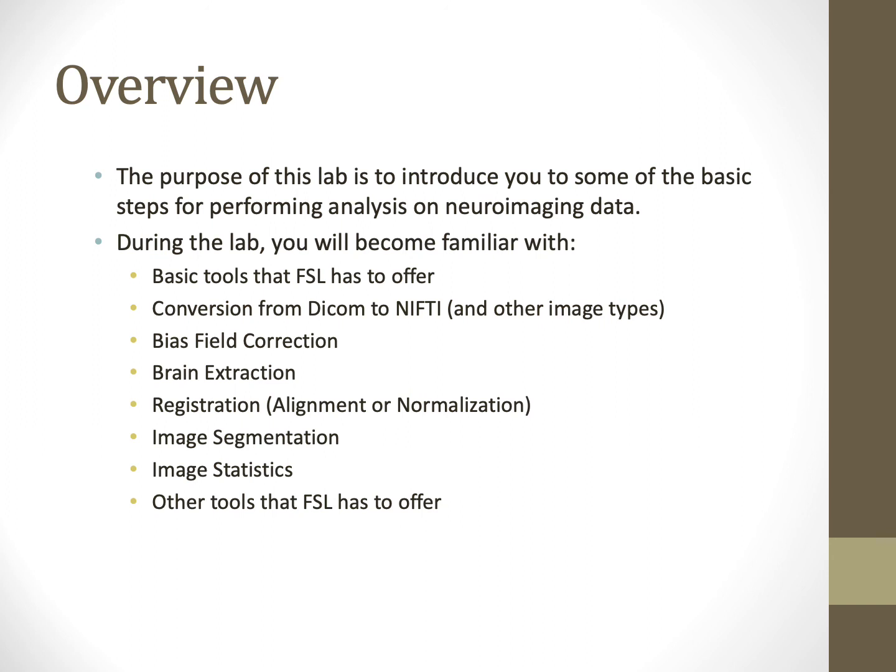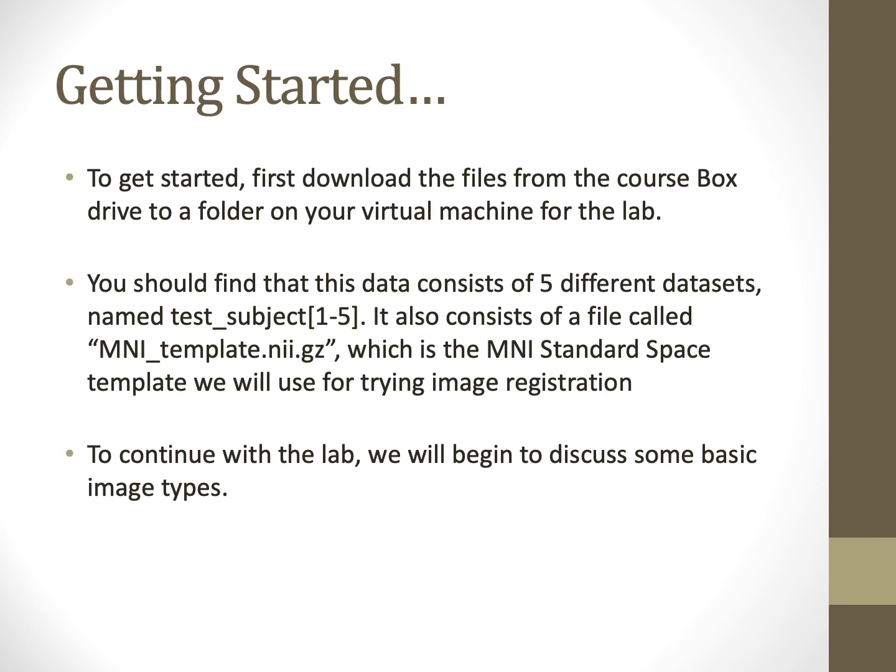The purpose of this lab is to introduce you to the basic steps for performing analysis on neuroimaging data. During this lab, you will become familiar with the basic tools that FSL has to offer. You will learn how to convert images from DICOM to NIfTI. You will learn how to perform bias field correction, brain extraction, image registration, image segmentation, and basic image statistics. To get started, let's first download the files from the course Box drive to a folder on your virtual machine for the lab.